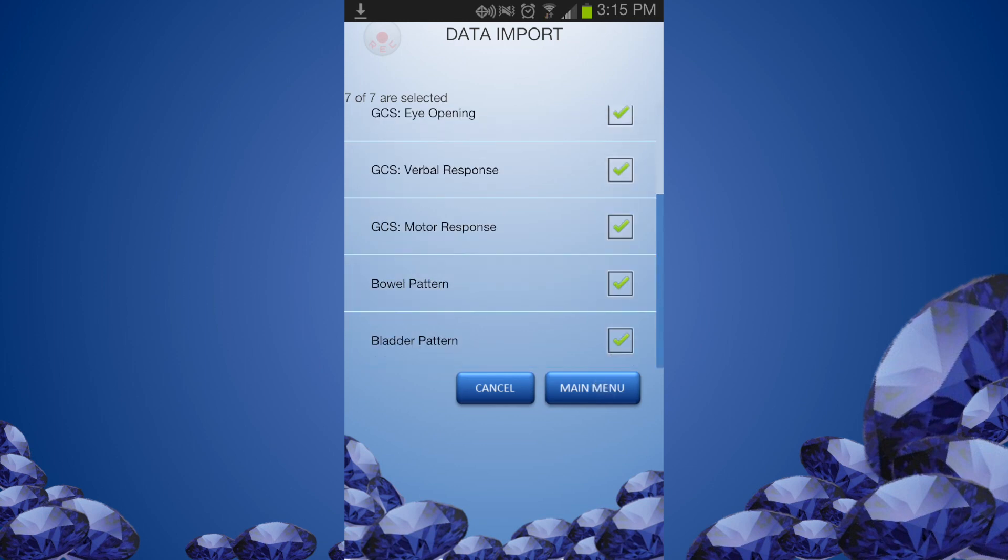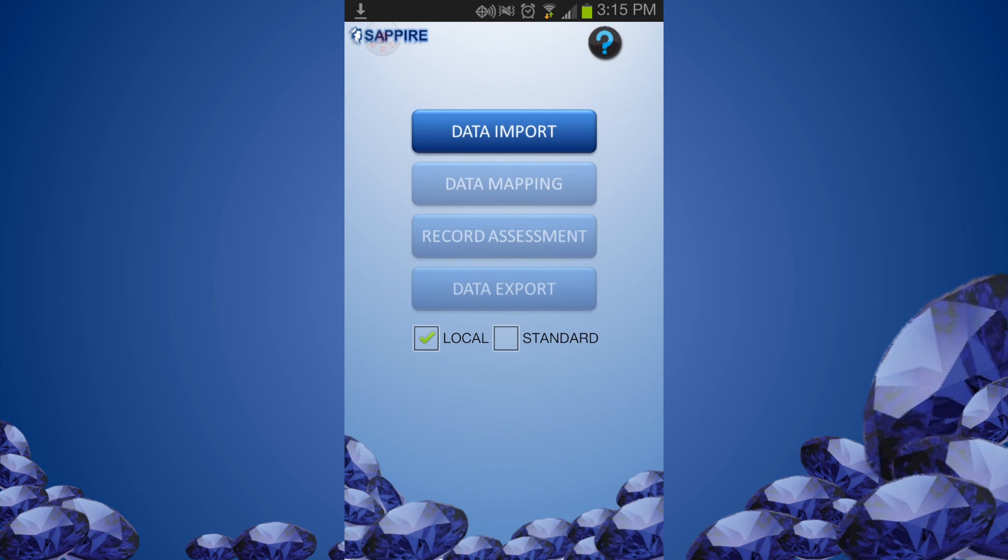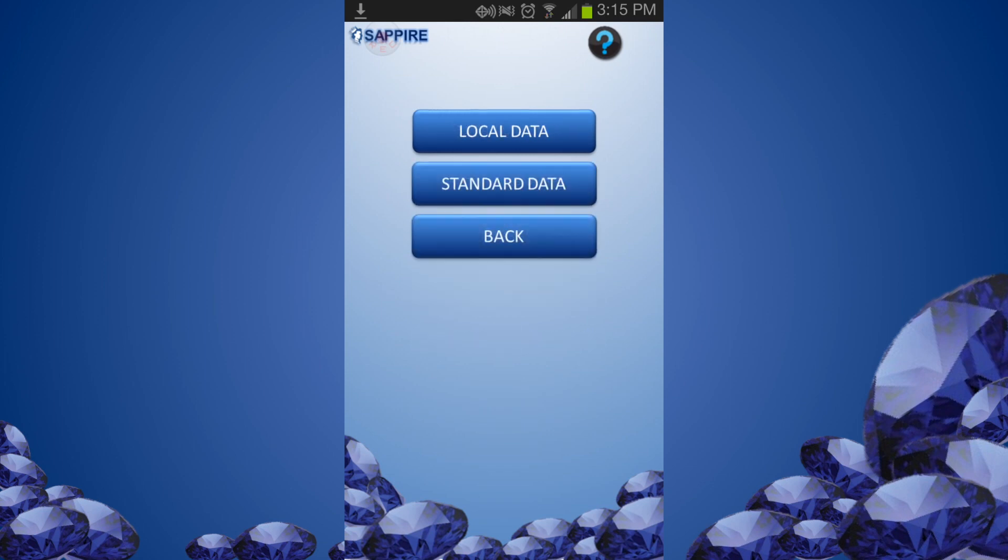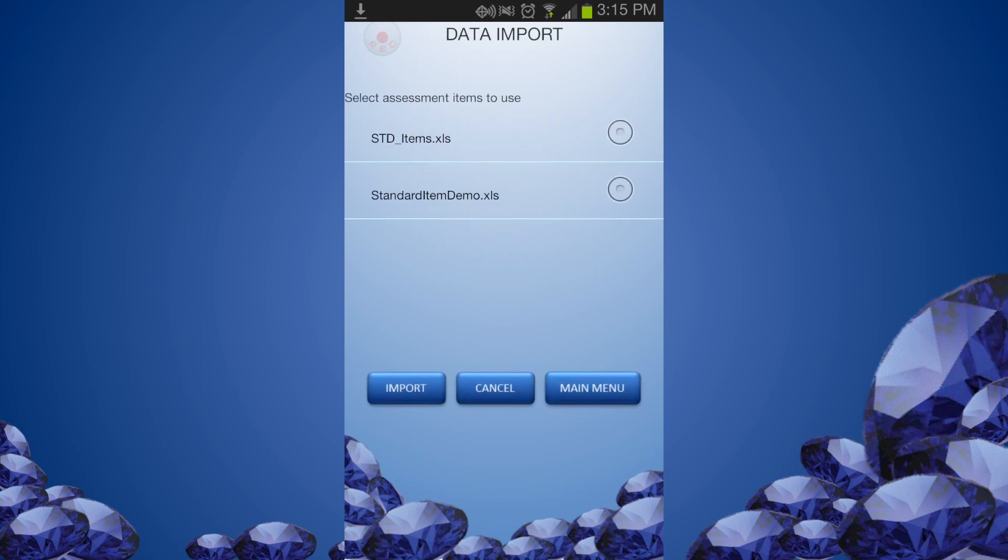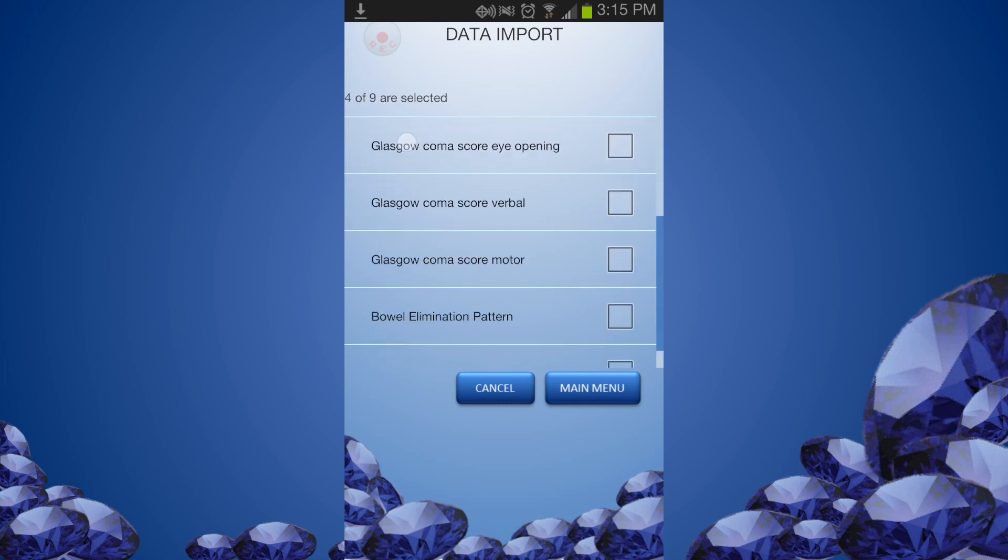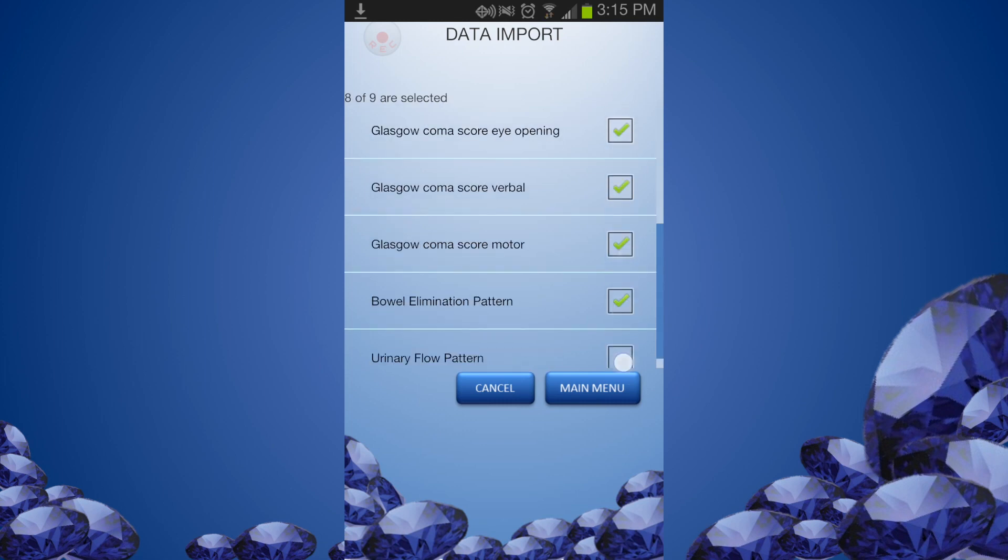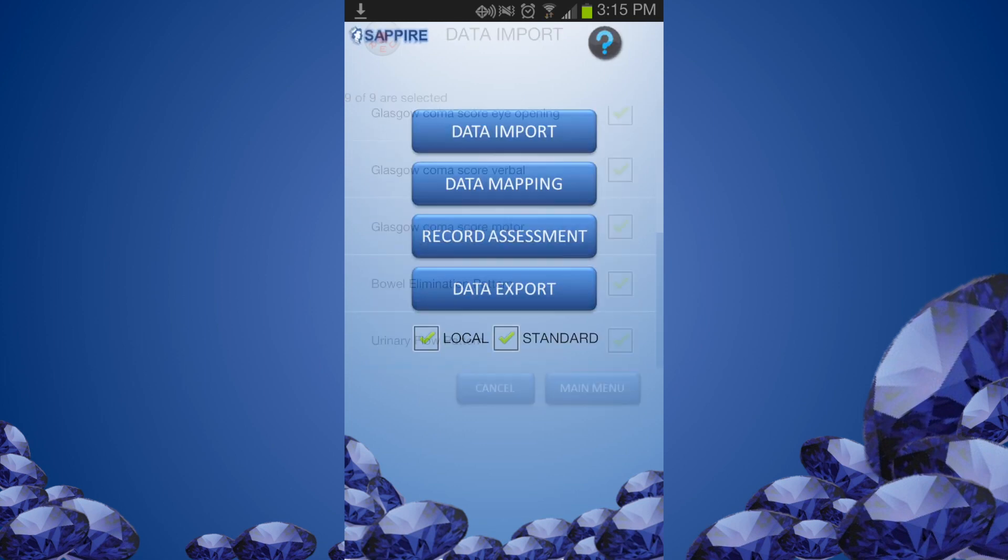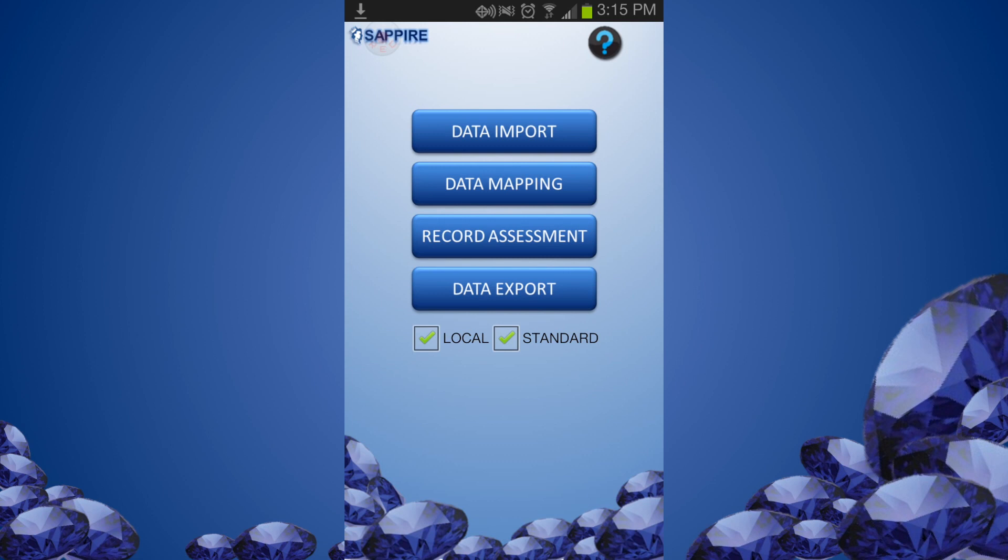Next we will import standardized assessment items. From the Data Import menu, select Standard Data. Select the standard data file to use, then click Import. Select the standard assessment items to use. The green check marks below show that both local and standard data files are imported. Now the Data Mapping button is enabled.